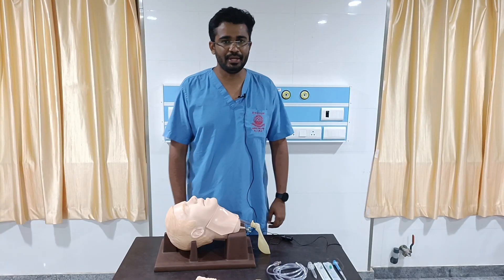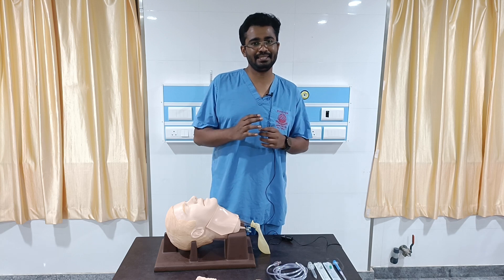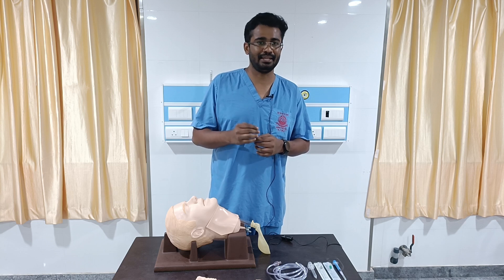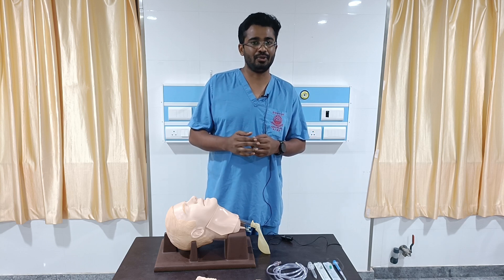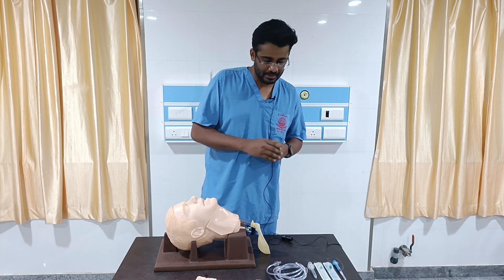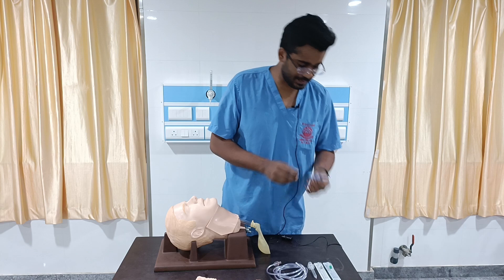Welcome to AGCL. Today we are going to learn about needle jet ventilation. Needle jet ventilation is a temporary technique which is used for ventilation in cases where there is an upper airway obstruction or if the other non-surgical airways have failed. For needle jet ventilation we need some equipment.